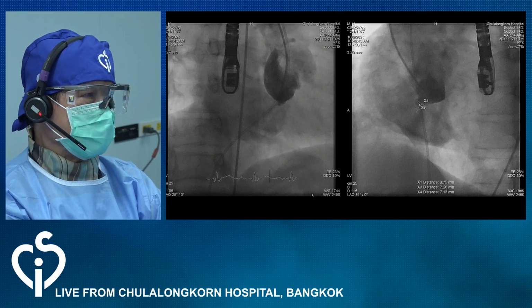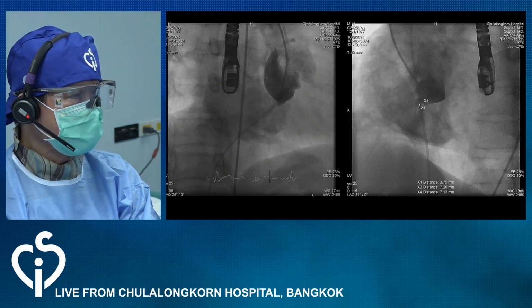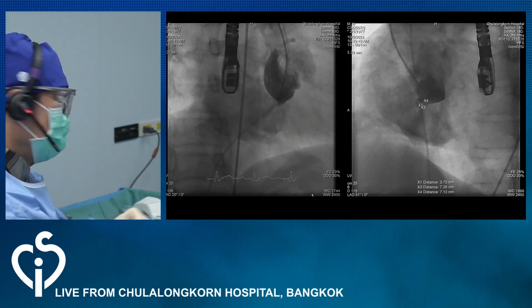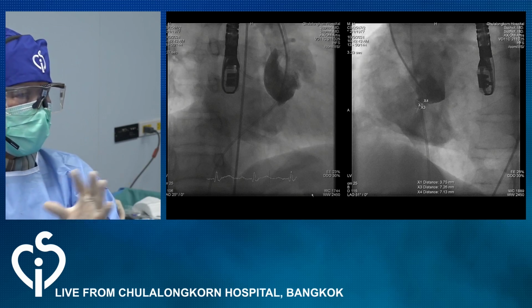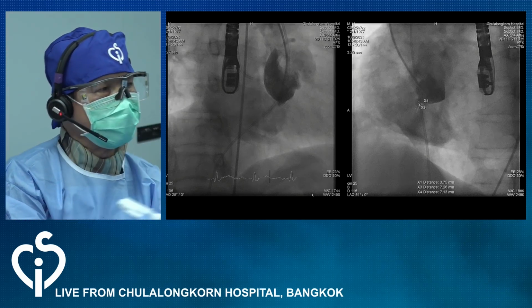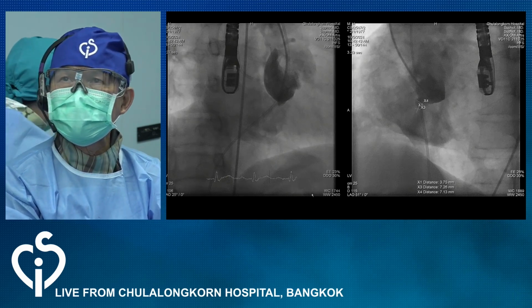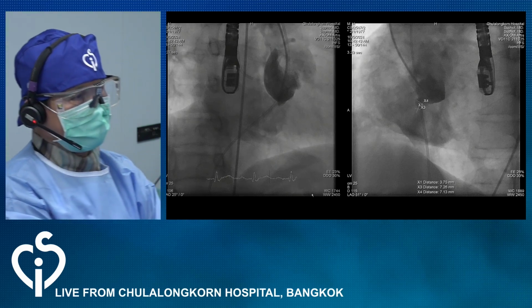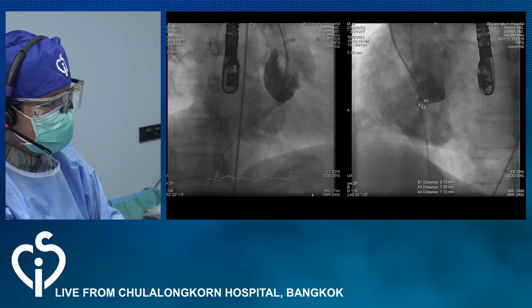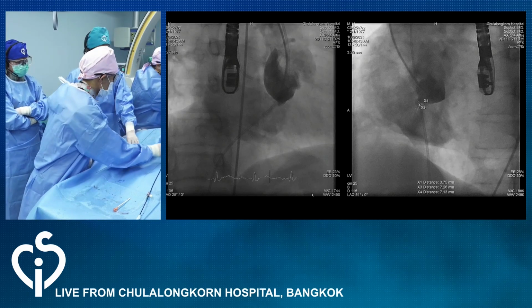So with the device size of 8/10, the RV end of the device will be 8, and the aortic end is 10, and the disc is 16. So Pontep is suggesting 10/8 ADO1. Right, let's just check with the panel.